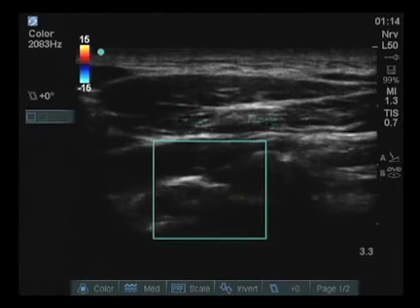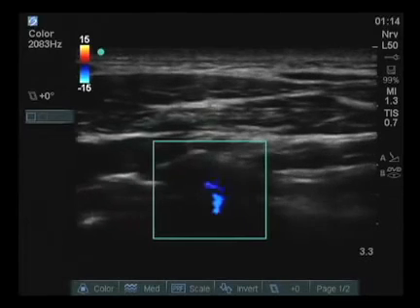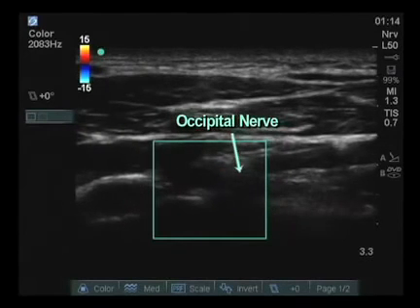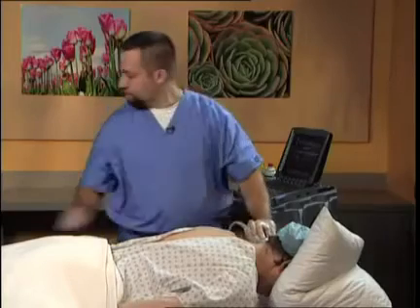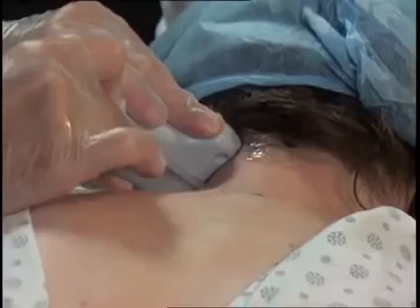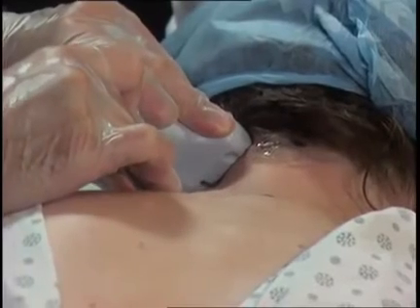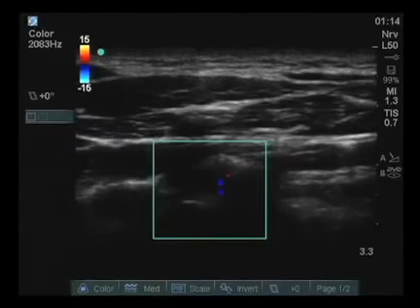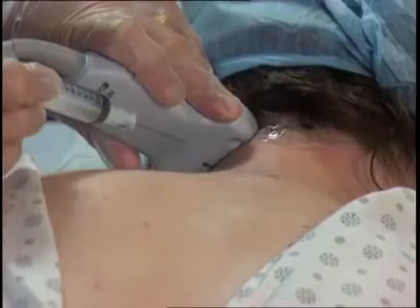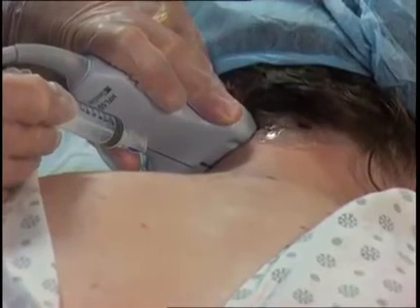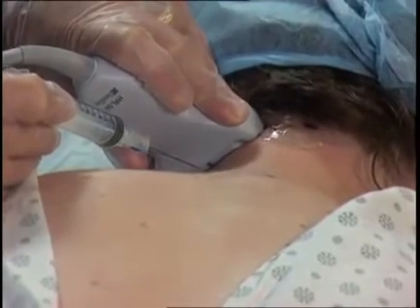Immediately medial to this is the location of the greater occipital and lesser occipital nerve prior to their branching. The injection would occur above — local anesthetic injected for the skin — followed by the one and a half inch needle to contact bone and avoid entry into the blood vessel.